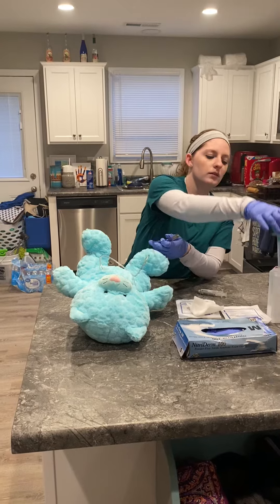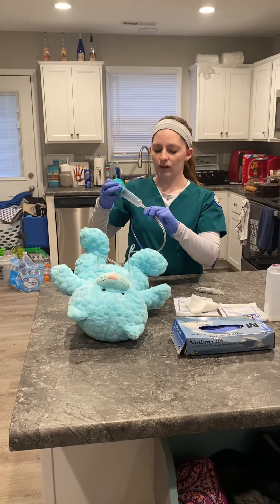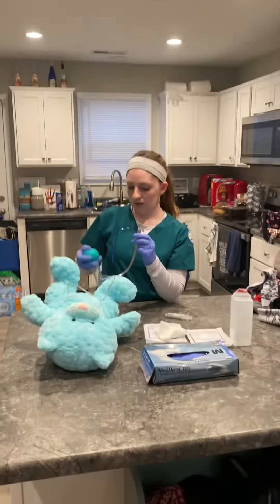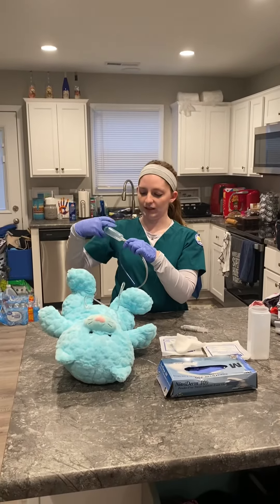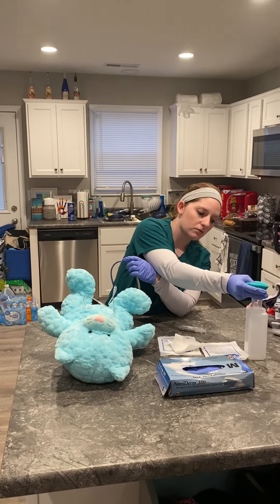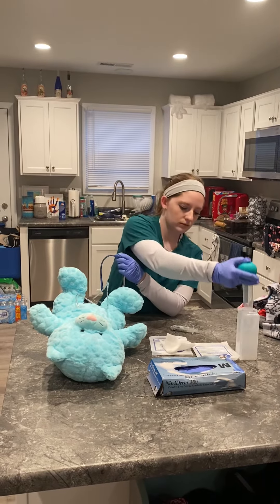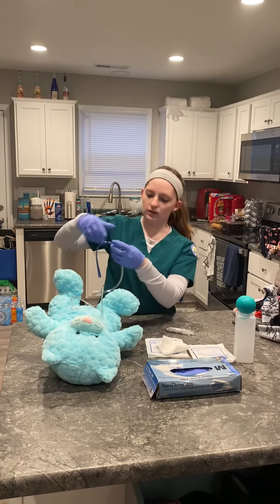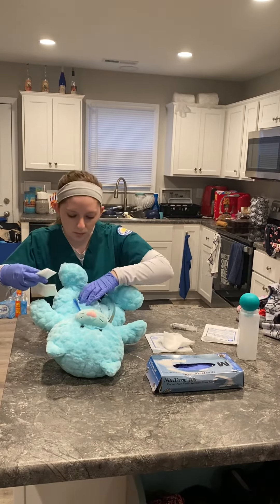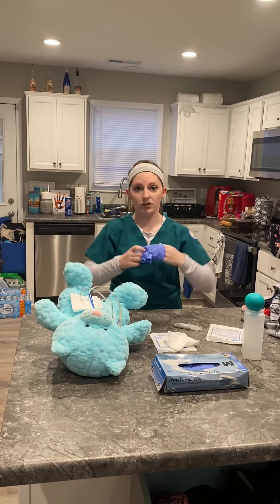I'm going to aspirate gastric contents, then check the pH on a litmus paper. Whatever gastric contents are left, I place back into my patient, then flush with 30 milliliters of water. I would then replace my dressing around the patient, remove my gloves, wash my hands, and document my procedure.